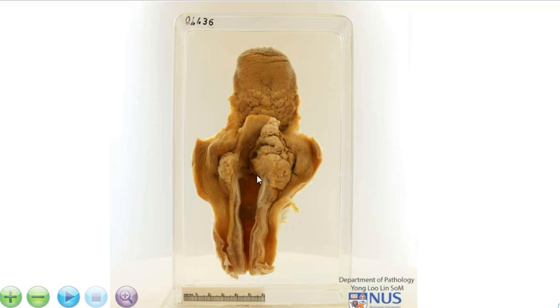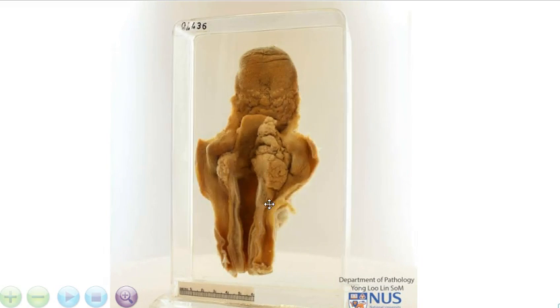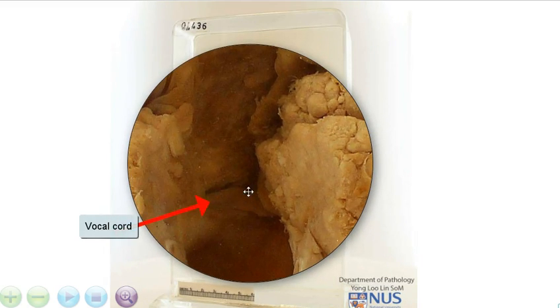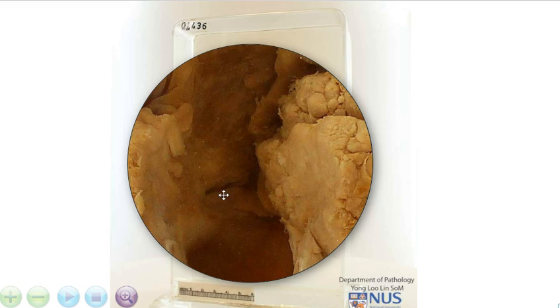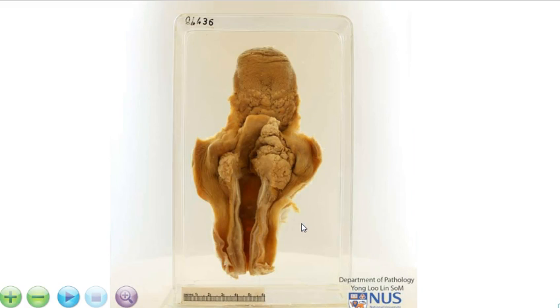So the tumours that involve the actual true vocal cords, which you can just about make out here — it's difficult to tell where this tumour started because it's so large now — but the tumours that start off at the true vocal cords will usually present a little bit earlier because the patient will experience hoarseness.